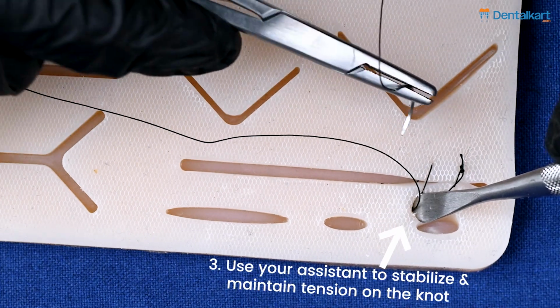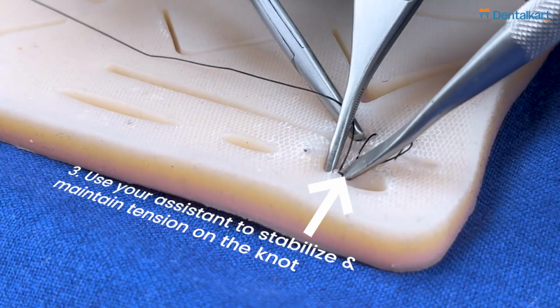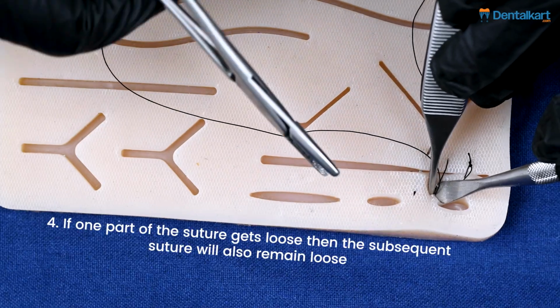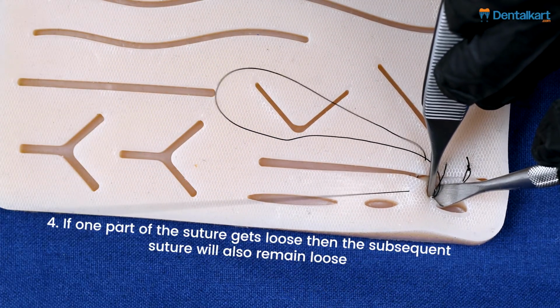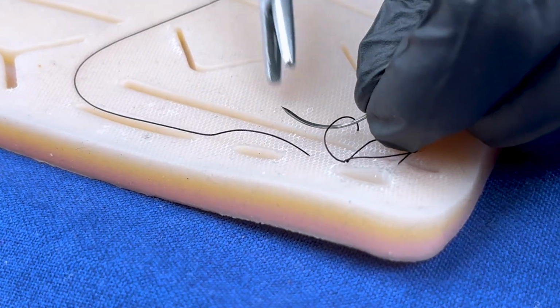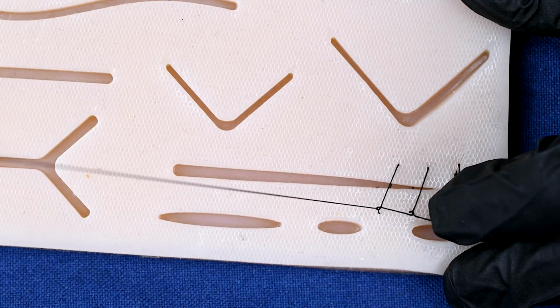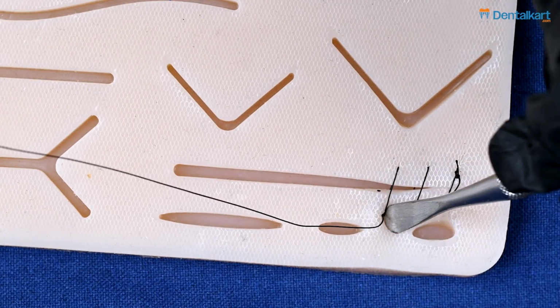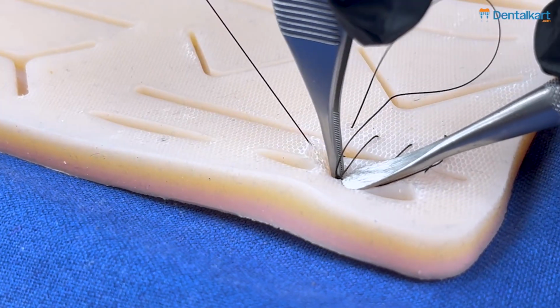Once we have adapted the knot, you can ask your assistant to maintain pressure on the knot so that it does not get loose. If one part of the knot gets loose, then the subsequent suture will also remain loose. So again, pass the needle before tightening it through the knot, hold the knot to maintain tension as much as possible, and then pass the needle through the next phase.